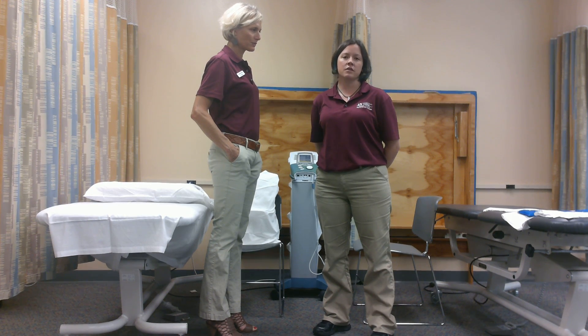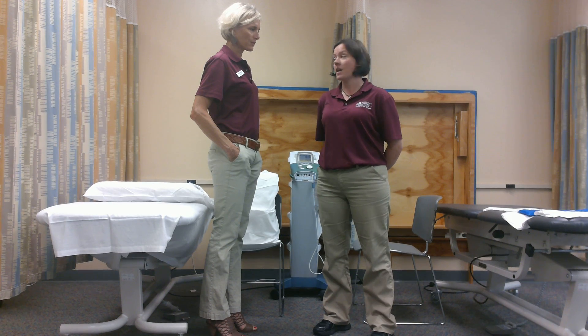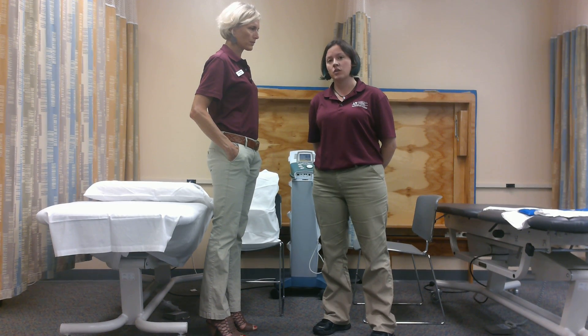Good morning, my name is Rhonda and I'm a physical therapist assistant student here at Miami-Dade Medical Campus. Today I'm with Hunter and we're going to be showing an application of an ice pack to her shoulder.